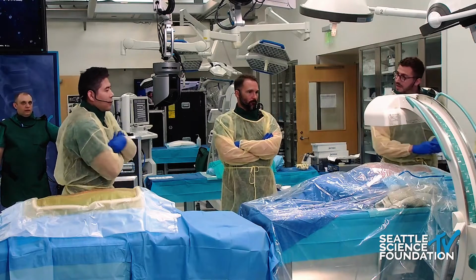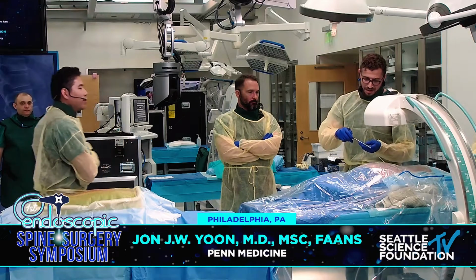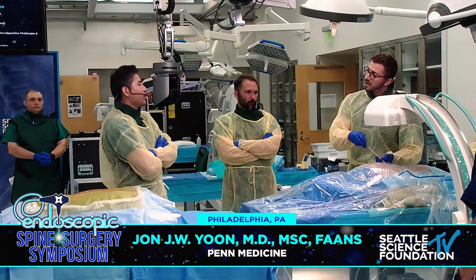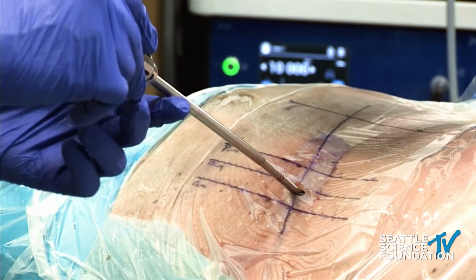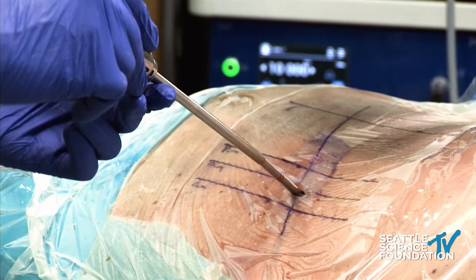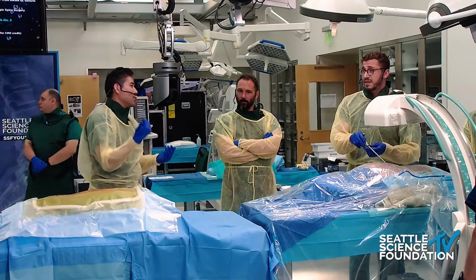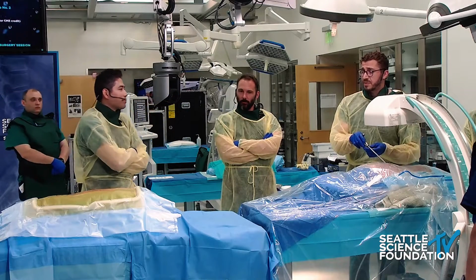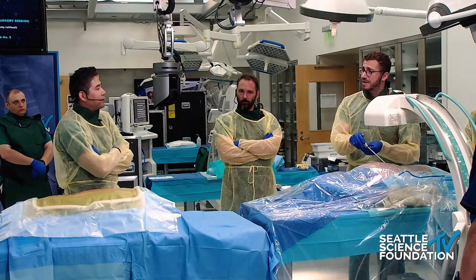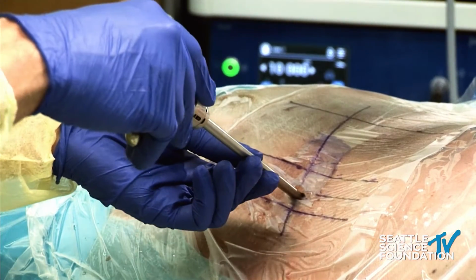Yeah, no, I feel the same way. If it's a collapsed and big facet joint, then I prefer reaming. That will make the bone removal a lot faster. Absolutely. And sometimes I think you can drag the bulging of the disc into the disc space during the reaming, and so by the time you get the scope in, the fragment is already loosened up, and you could just pituitary it. That's a great point, especially if you're going for a synovial cyst, a lot of times you pop the cyst with the reamer, right. So there's a lot of things that ruffle things up in there for sure. Right. That's actually a great point for sure.